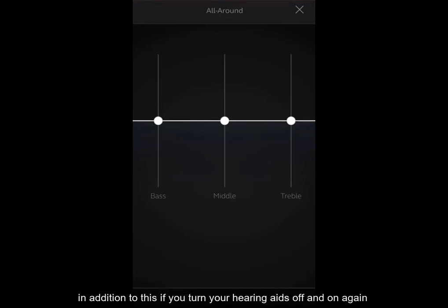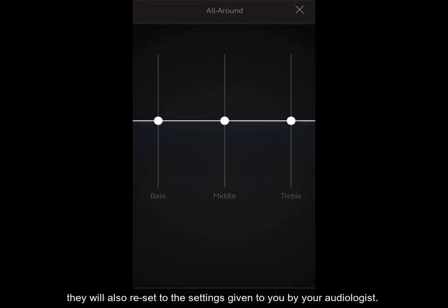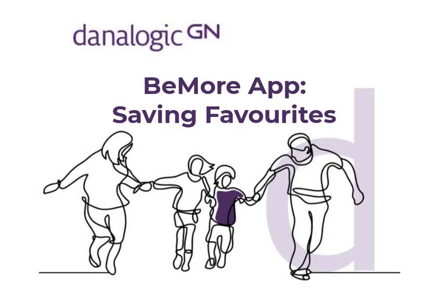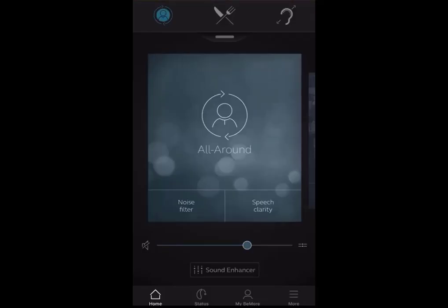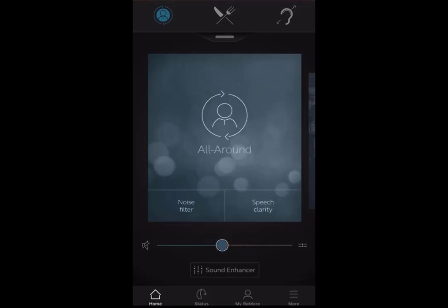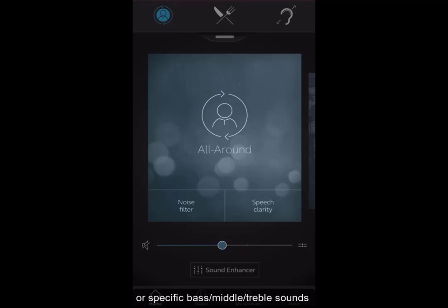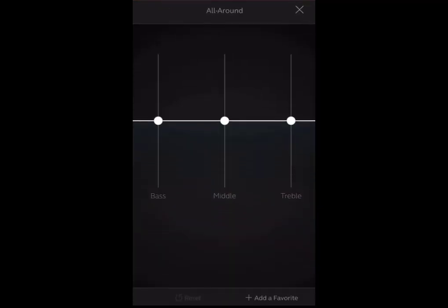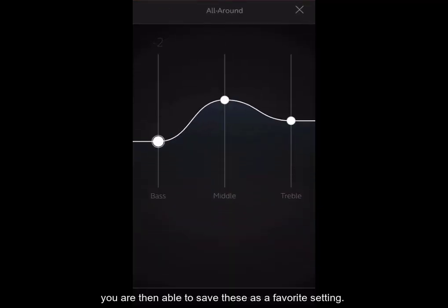In addition to this, if you turn your hearing aids off and on again, they will also reset to the settings given to you by your audiologist. If you were to make changes either to the overall volume of your hearing aids or specific bass, middle, treble sounds, you are then able to save these as a favourite setting.